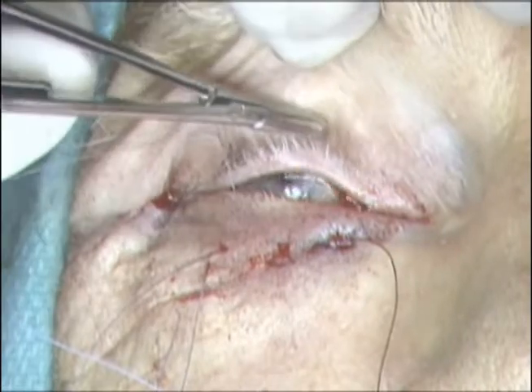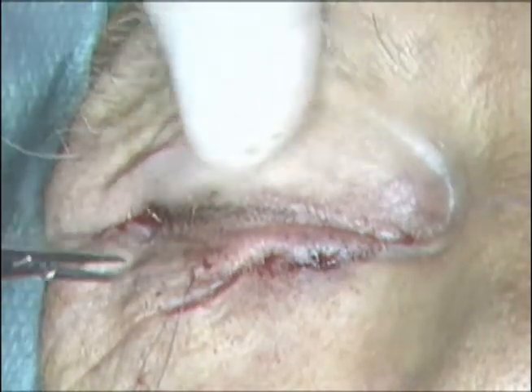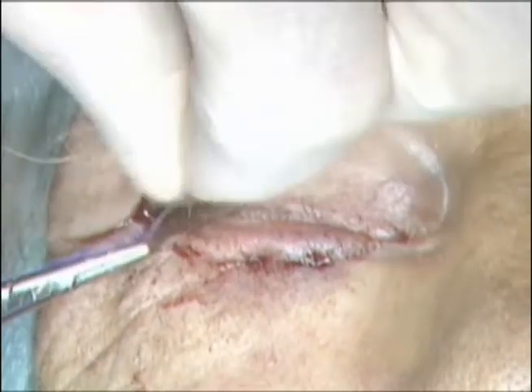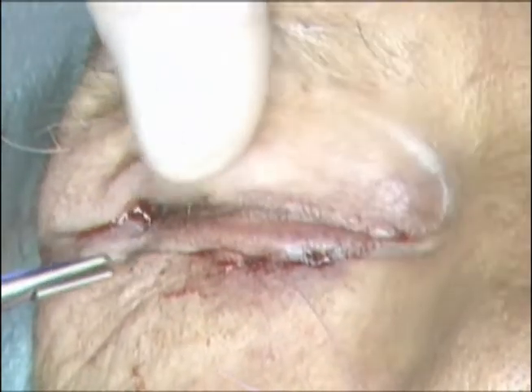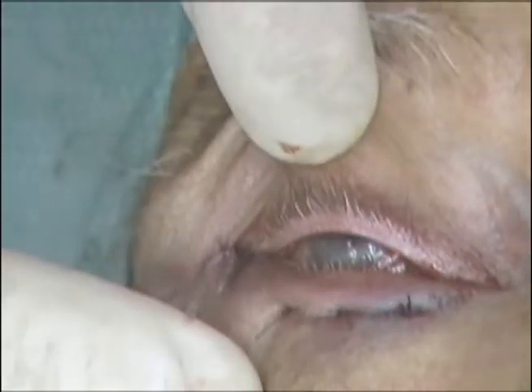The inverting sutures are then tied to gently invert the lower lid. These can be tied over bolsters if preferred. My goal here is to usually have the lashes of the lower lid be vertical at the conclusion of the case. The lateral canthotomy incision is then repaired with a 7-0 Vicryl suture.